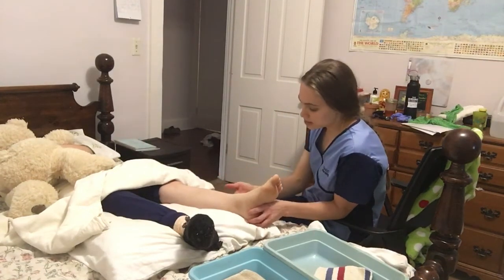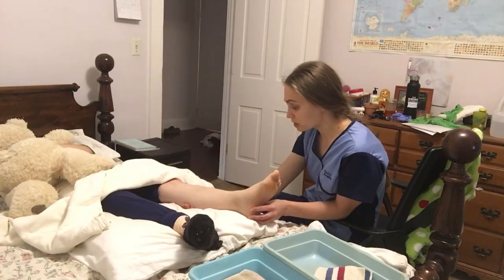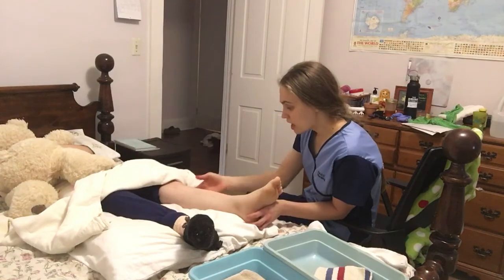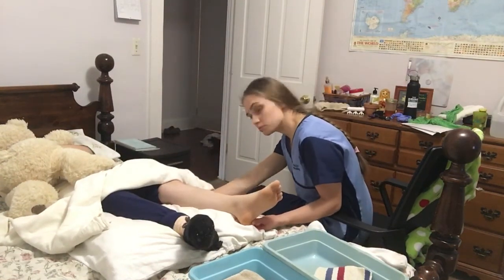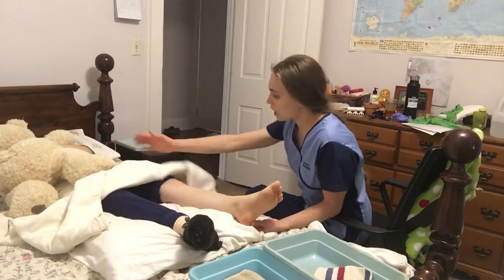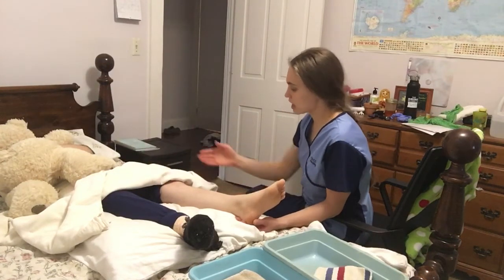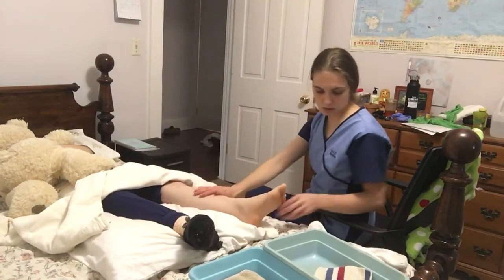So next, the way to measure for TED stockings — for knee-high TED stockings — would be to measure around the widest part of the calf, and then measure from the heel or the Achilles tendon to the popliteal fold for knee highs. For thigh-high stockings, I would measure from the Achilles tendon to the gluteal fold. But for this case, I'm doing knee highs.